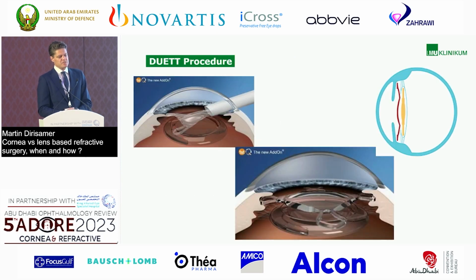So what is this duet procedure? I explained it already. First, we put a monofocal IOL, toric or not toric, depending, in the capsular bag and put a multifocal add-on IOL on top. It gives you some kind of additional benefit, so you have some more options. If you really have to deal with a macular issue in high myopes, or even retinal detachment, whatever, it might be very easy to just pull out this sulcus-fixated IOL because the material is very soft and it's very easy.